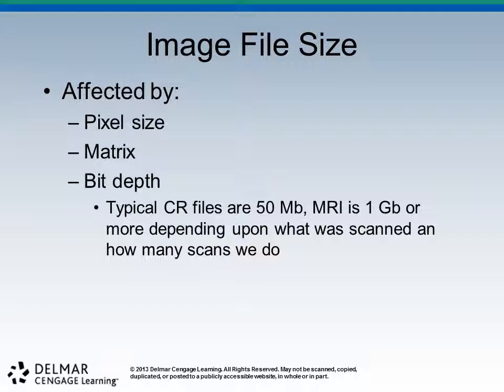So when we do an MRI study, and if we're lucky, we're going to do 12 to 14 or 16 a day. We're going to pop through a gig or more per patient. So that all has to be paid for. And remember what I said, if we've got a 1 gig MR study, that's really 2 gigs, isn't it? Because we're going to duplicate this and store one on site and one off site. So all of this doubles, and that's money.